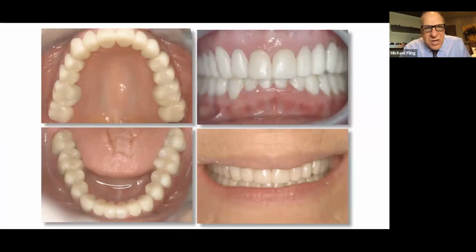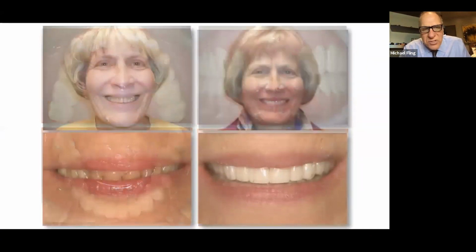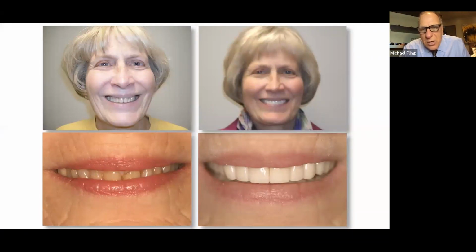So now she's provisionalized everywhere, and now I can transition into permanent crowns in whatever sequence you want to do. So that's the technique that I use.